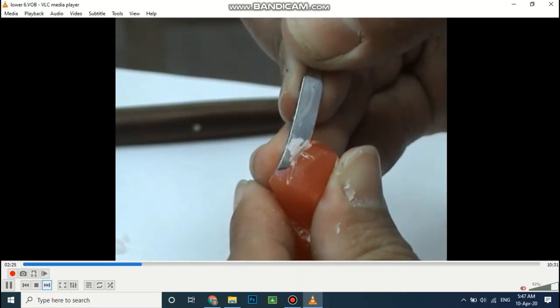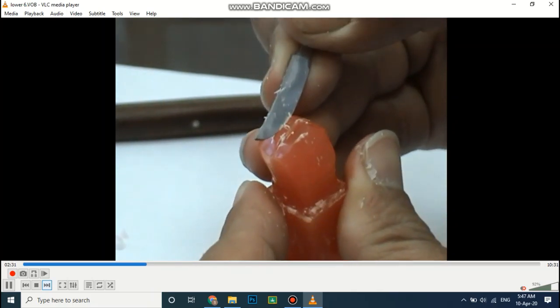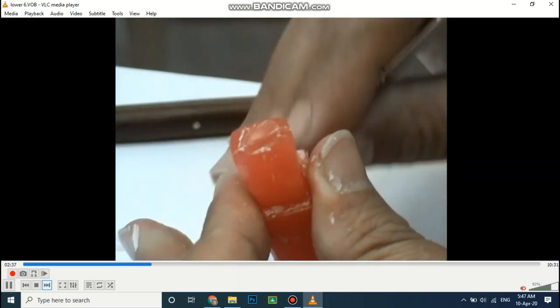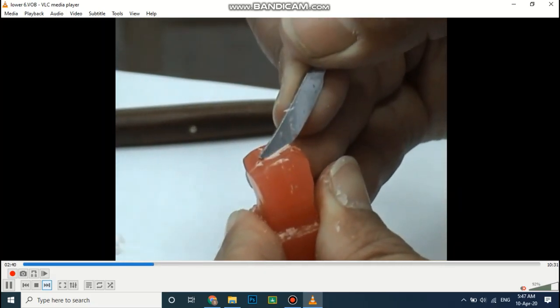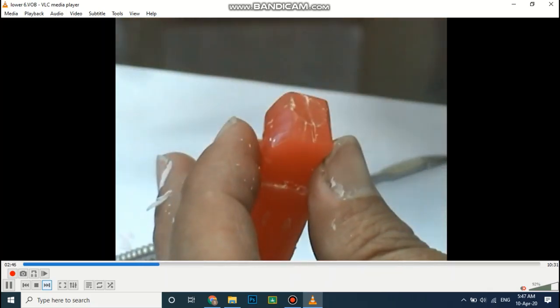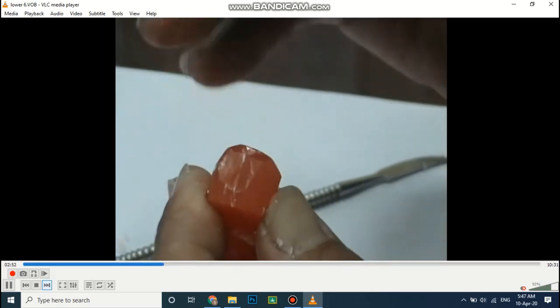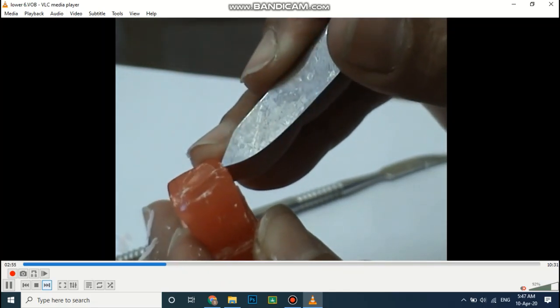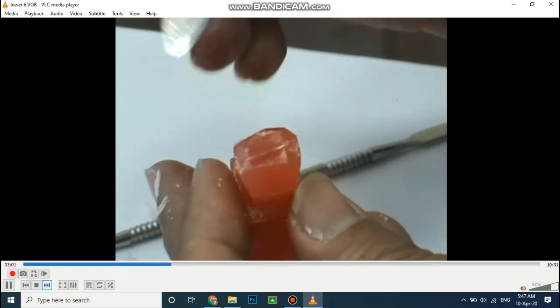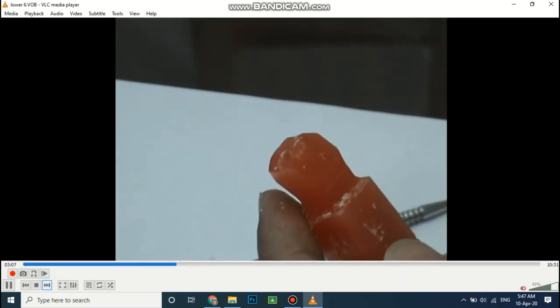A V-shaped notch is done now to separate the buccal from lingual cusps. The knife or carver should be parallel to the buccal surface, meaning that it is directed towards the lingual surface from the distal aspect. After that, we have to separate the 3 buccal cusps, but first we will do the mesial and distal triangular fossae by the tip of the knife. Pay attention that the mesial triangular fossa is not at the same level as the distal triangular fossa. The distal is directed slightly lingually.